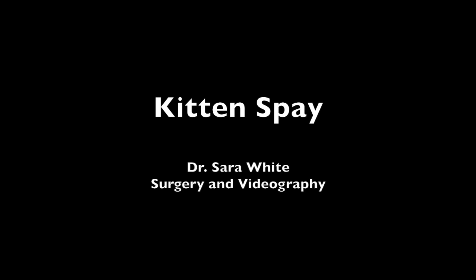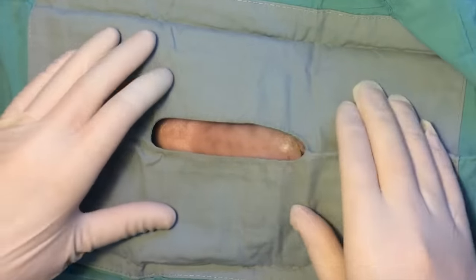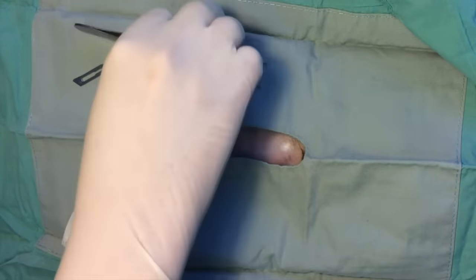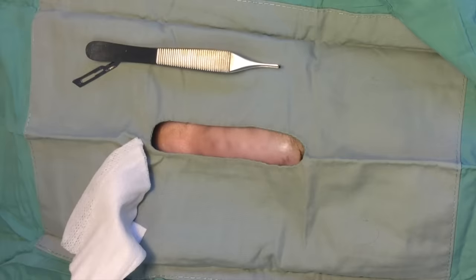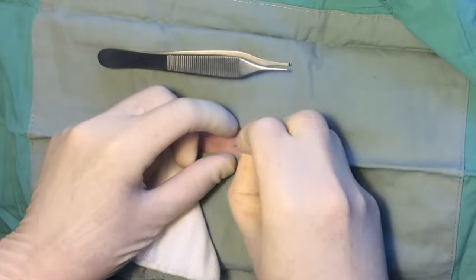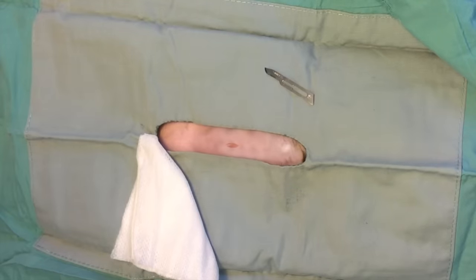Kitten spay. Kitten spays are some of my favorite surgeries. The kitten in this video is a shelter kitten about 8 to 10 weeks old, weighing 1 kilogram or 2.2 pounds. The kitten is clipped and surgically prepped from the umbilicus to the brim of the pelvis. A sterile surgical drape is placed. A 1 centimeter incision is made at the midline, halfway between the umbilicus and the brim of the pelvis.